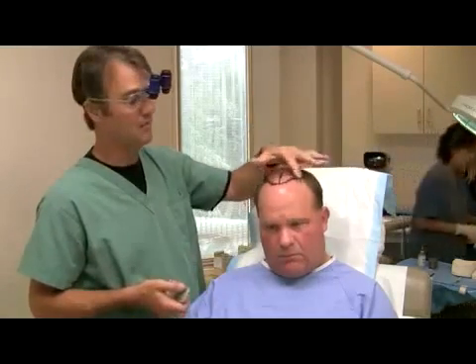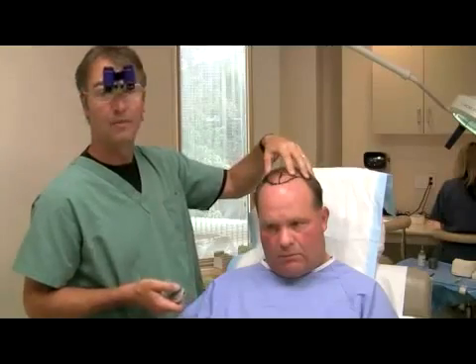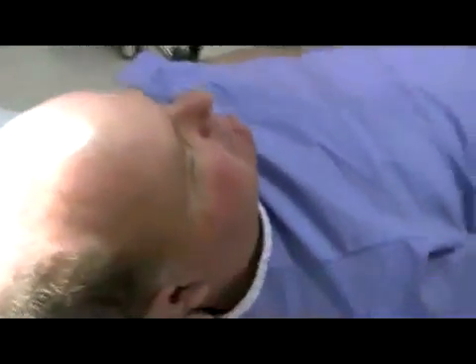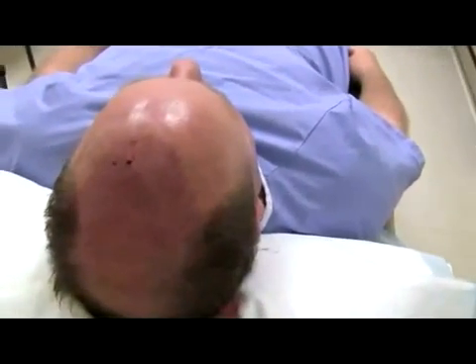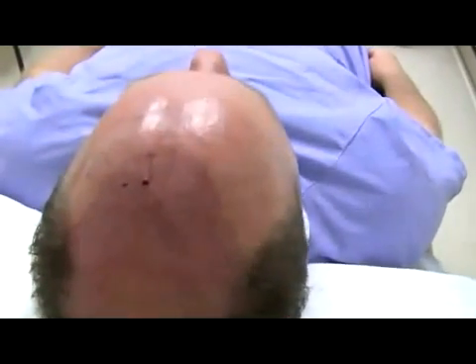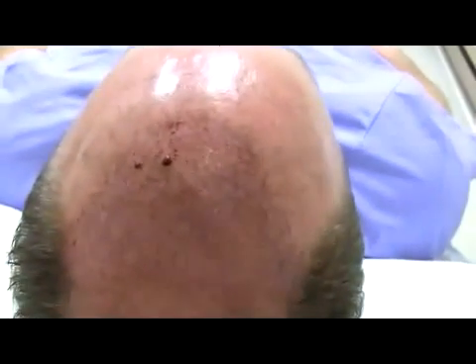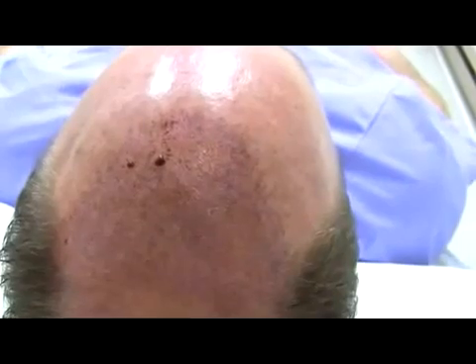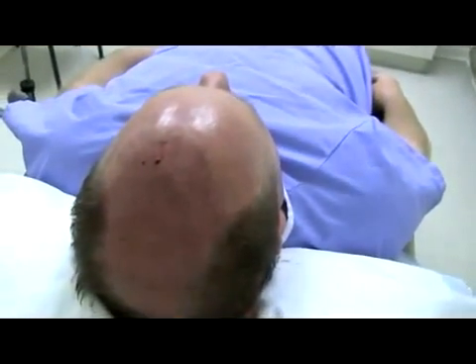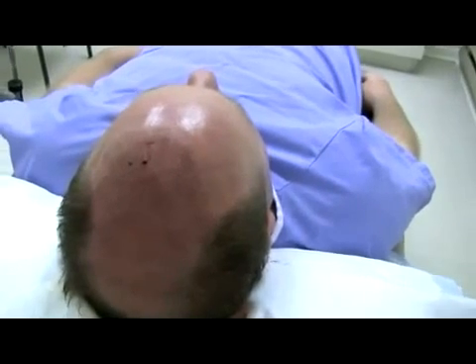So the next step is to numb up this area and make some recipient sites. We've now finished making the recipient sites, so you can see on the top of Don's head here, we've made about 2,000 small sites. So the next step is just to fill those sites with grafts. We've tried to make that up to about 40 or 50 grafts per square centimeter in the top. And we'll start planting in a few minutes.